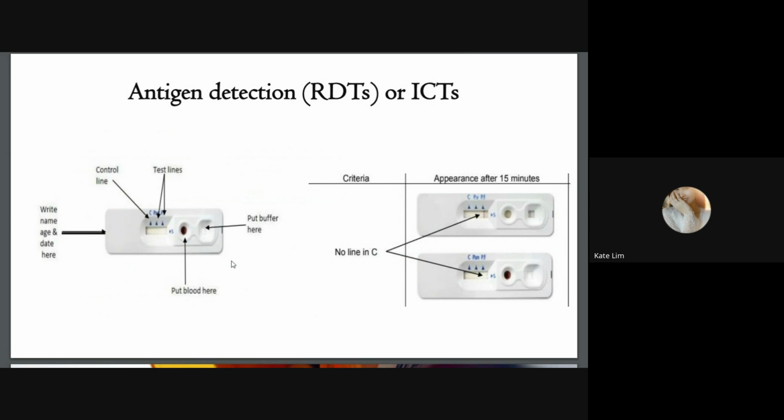So, usually, if RDTs can be done by non medtechs, they can be done by volunteers. So, this is how effective and simple this test or this kit is.